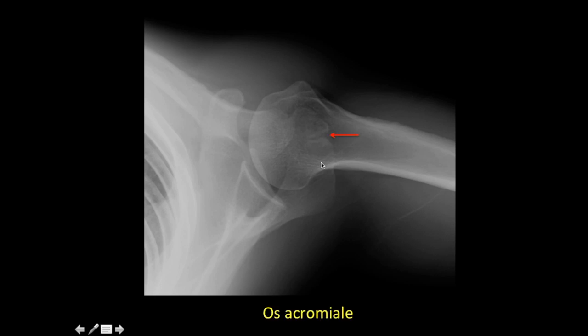In this patient you can see a well-corticated body with a radiolucency — this is not an acromion fracture but an os acromiale. Be careful before reporting an os acromiale as an acromion fracture in younger individuals less than 23 to 24 years old, as an os acromiale may be present.